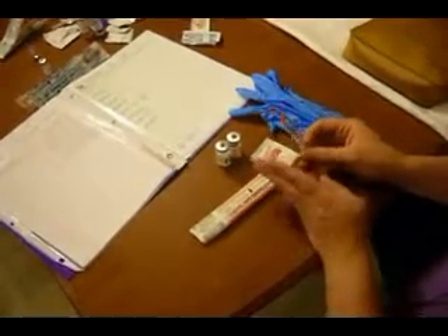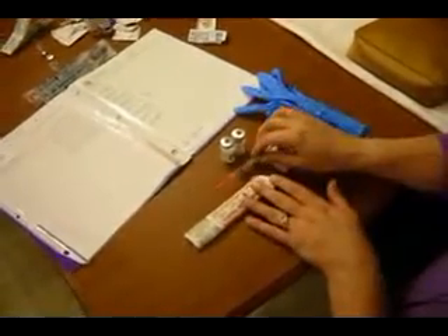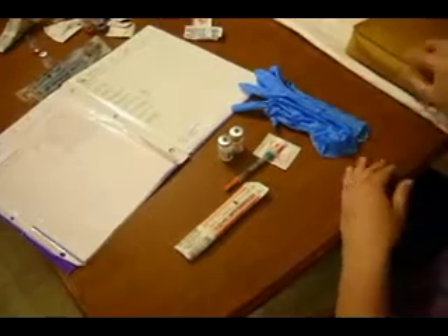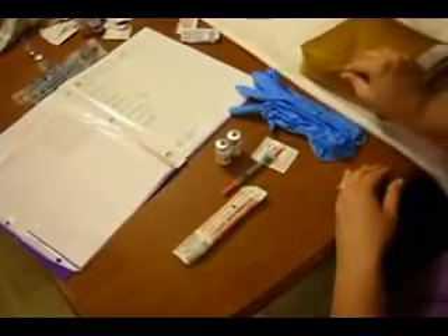Once we have that ready, we're going to transition to our patient. We need to make sure that we've washed our hands. If we were drawing it up outside the patient's room, we'll wash our hands once we get into the room, discuss with our patient what we're going to do, get them ready, and prep their site.